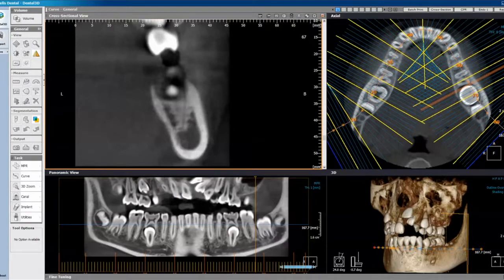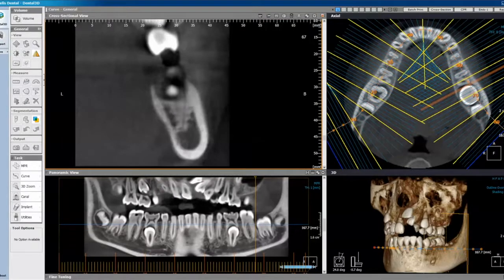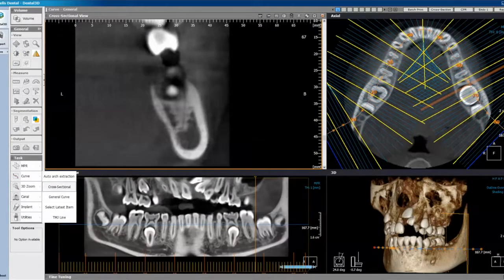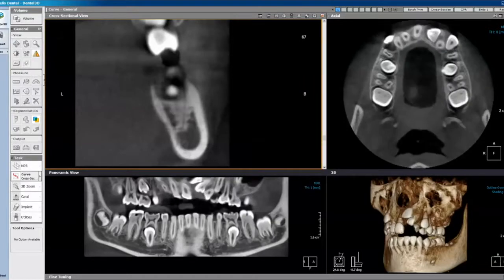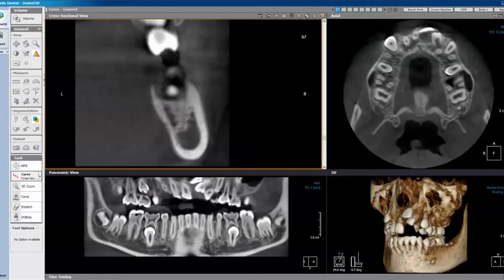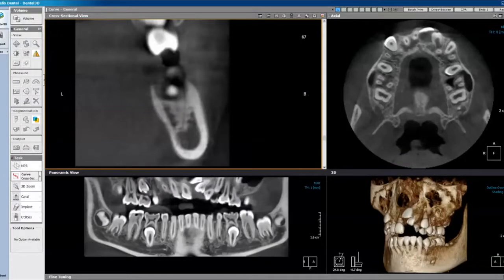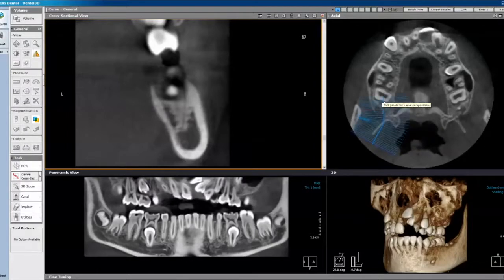Now I'm going to create another curve. Let's assume that my area of interest was in the maxilla and I wanted the arch to be along the path of the maxilla. I'm going to do this manually this time. I'm going to select the curve icon, select cross section. I'm going to look in the upper right pane and adjust the axial slice to represent the maxillary anatomy. Then I'm going to start selecting the points for the curved composition, starting in the upper right behind the pterygoid plates, by clicking the left mouse button.